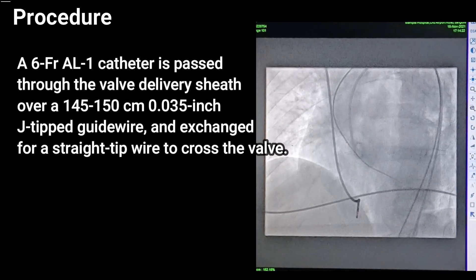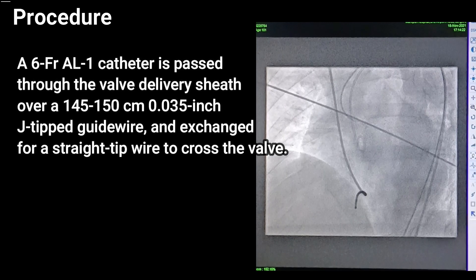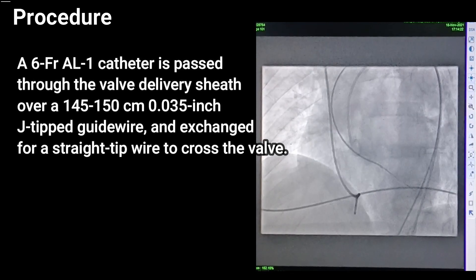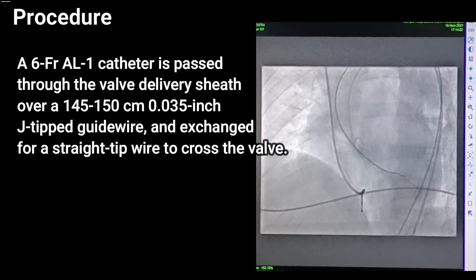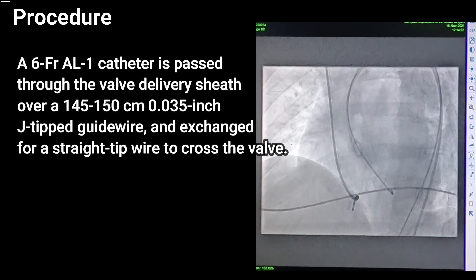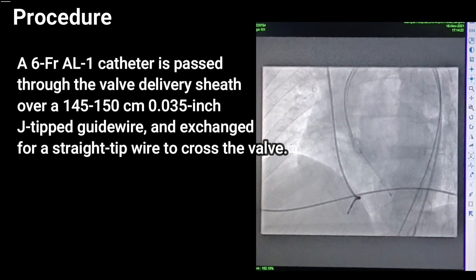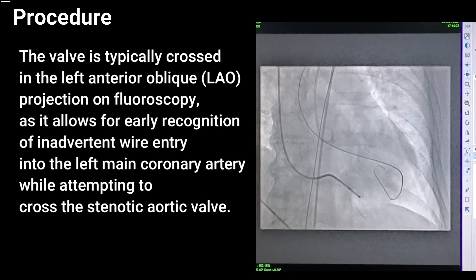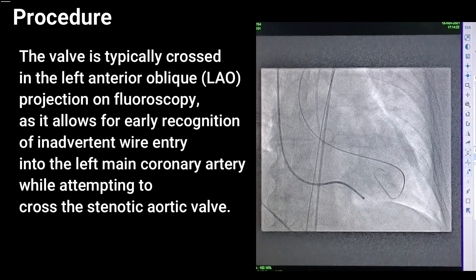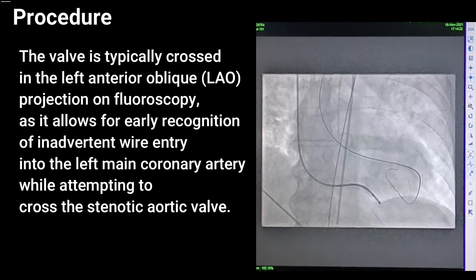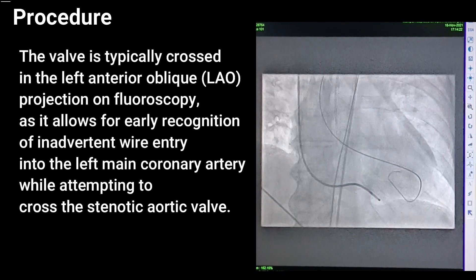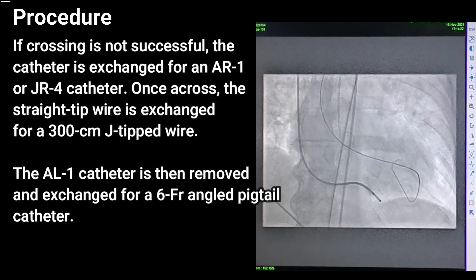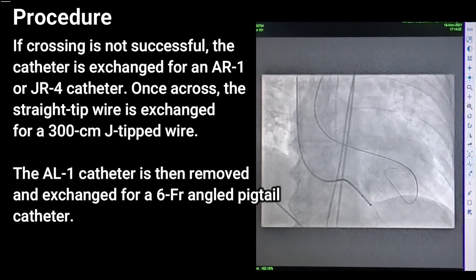A 6-French AL1 catheter is passed through the valve delivery sheath over a J-tip guide wire and exchanged for a straight-tip wire to cross the valve. The valve is typically crossed in the left anterior oblique projection on fluoroscopy, which allows early recognition of inadvertent wire entry into the left main coronary artery while attempting to cross the stenotic aortic valve.